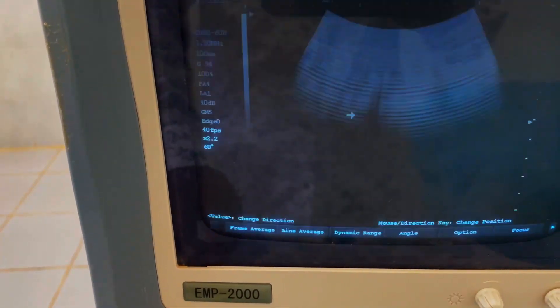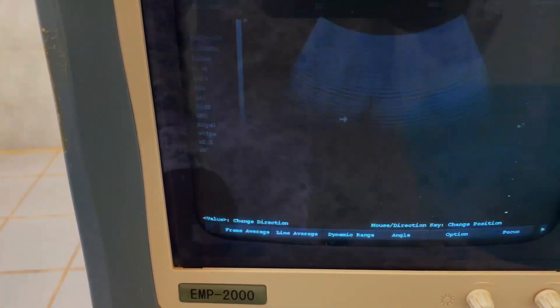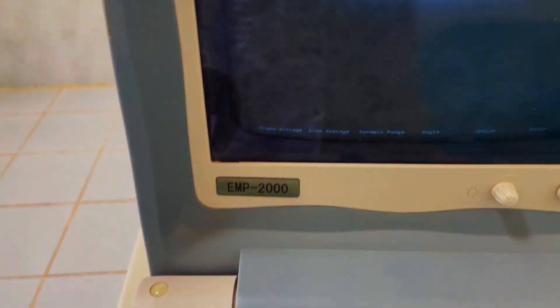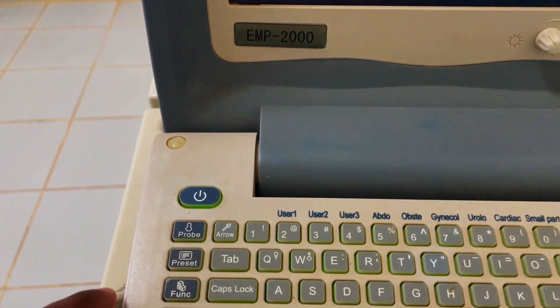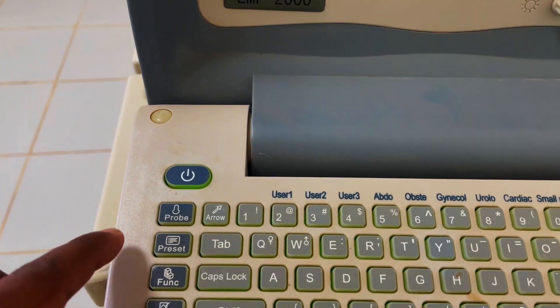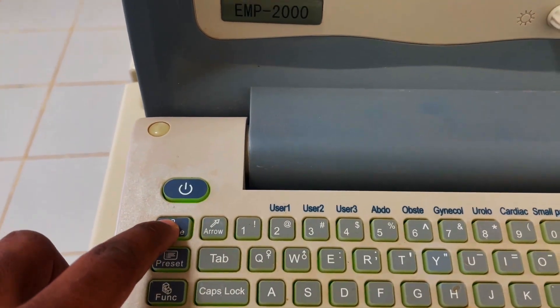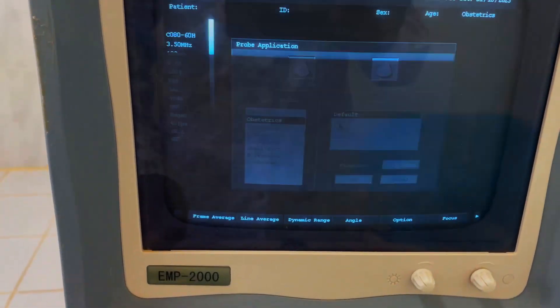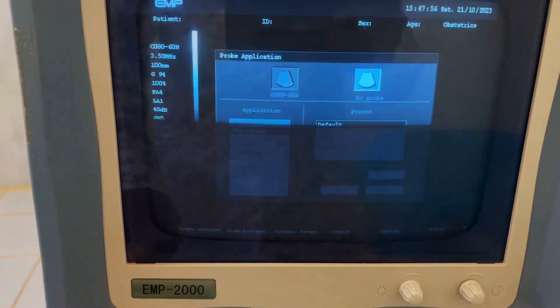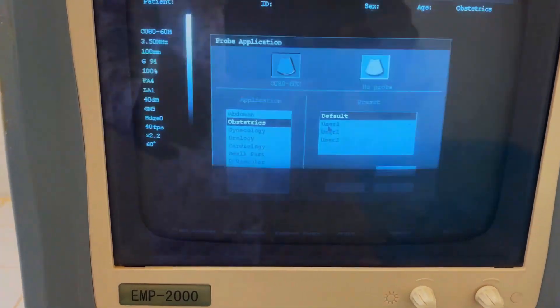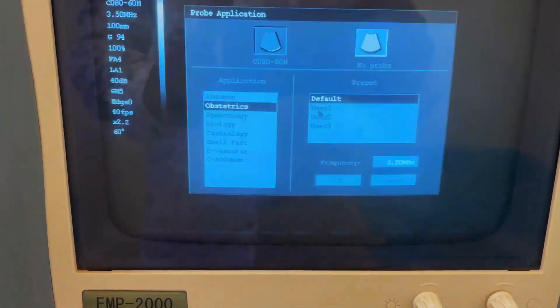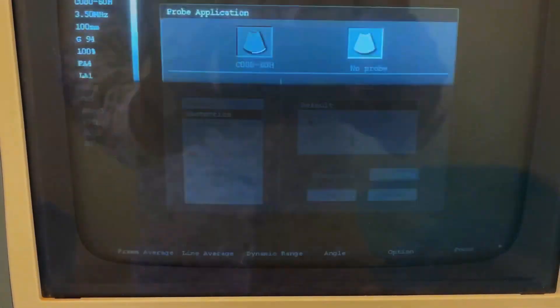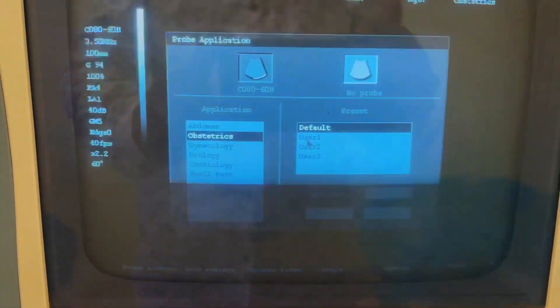Press it again and it will disappear. Press and it appears again. Now press the probe button. After pressing the probe button, different types of examination systems are shown on the screen.